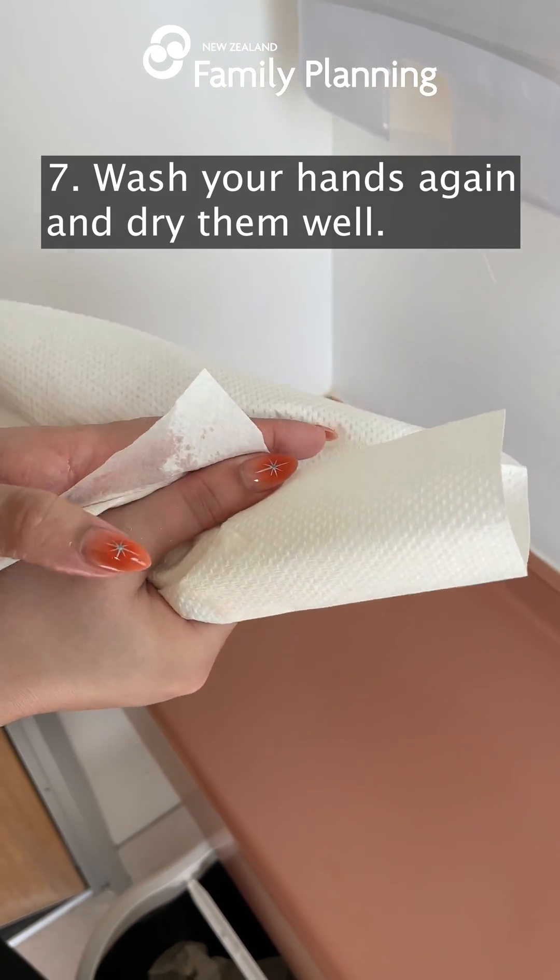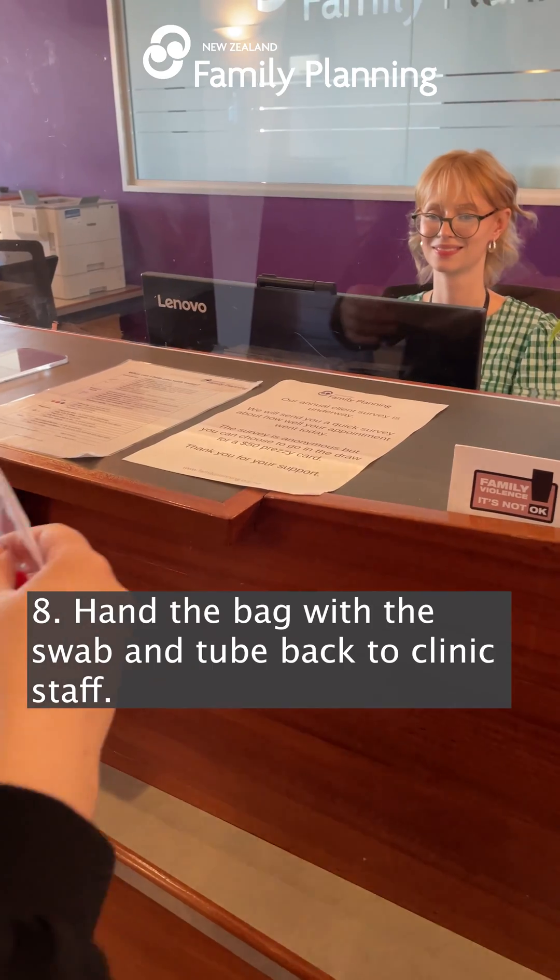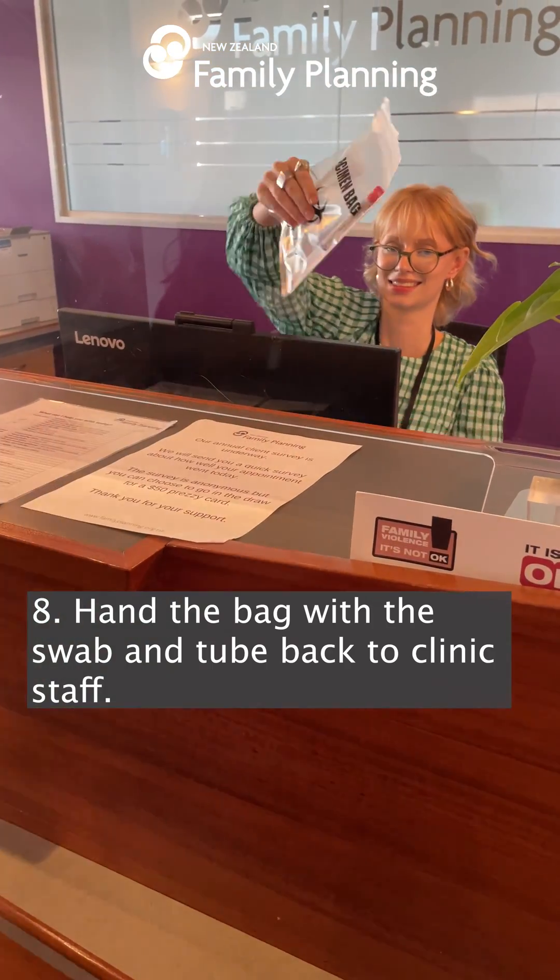Wash your hands again and dry them well. Hand the bag with the swab and tube back to clinic staff.